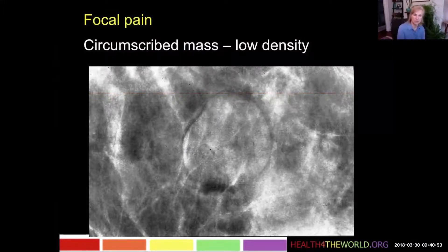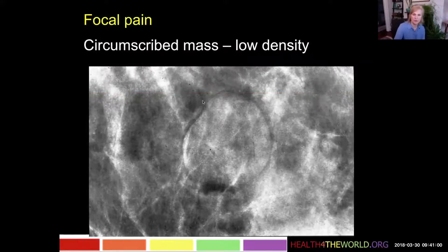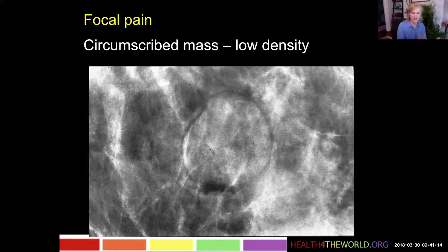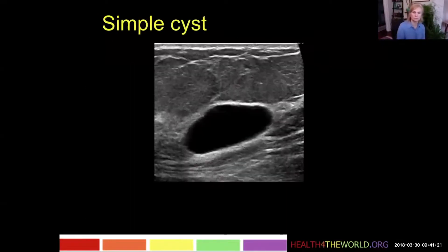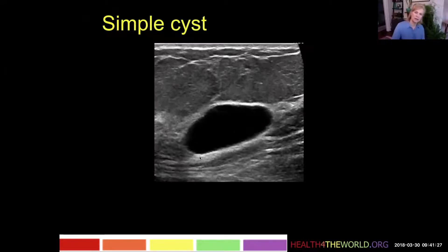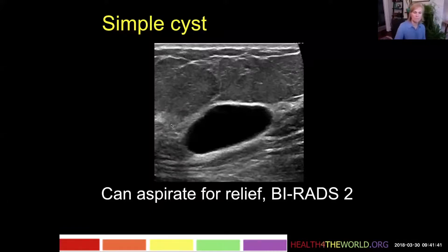Here's a patient with focal pain. We see a circumscribed mass with very smooth margins. It has a fairly low density throughout, not much denser than surrounding tissue, suggesting it's a flat lesion rather than a round one — making me think it's a cyst without a lot of fluid, easily compressible at mammography. Sonographically, we see a classic simple cyst: completely anechoic, enhanced through transmission, smooth margins. This is a simple cyst — benign, no treatment needed unless aspiration for pain relief.